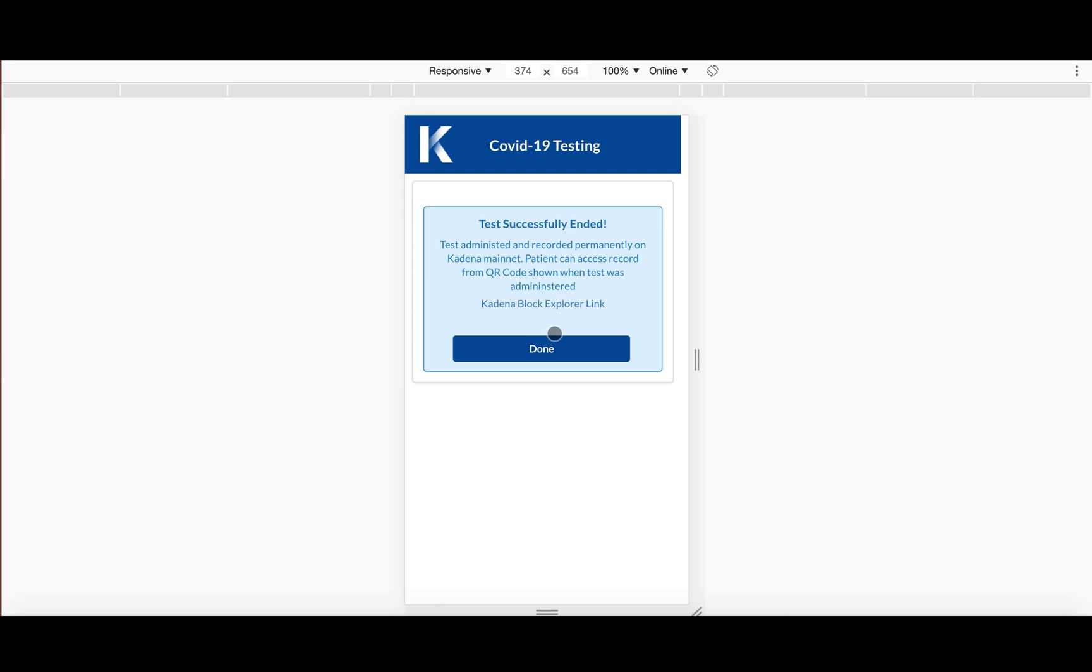Okay. So here the transaction went through, we ended the test successfully. And as I mentioned, we did the result of positive.